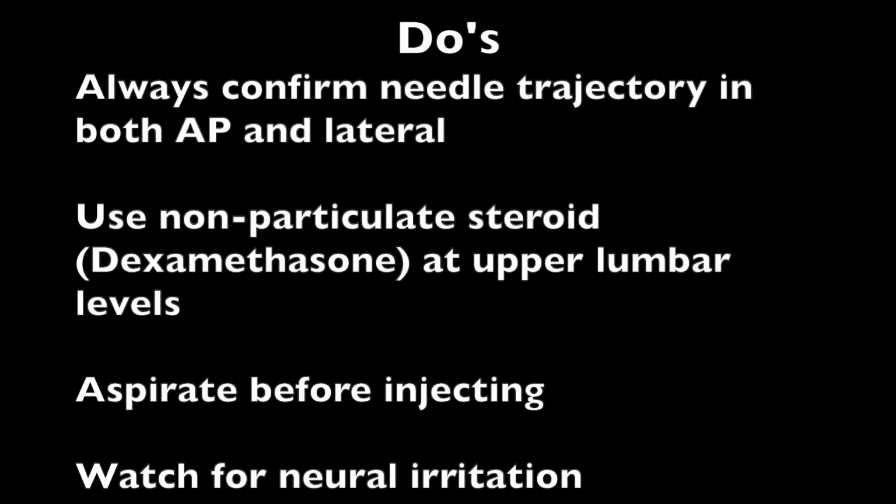The do's of the procedure include: confirm needle trajectory in both AP and lateral views, use non-particulate steroids like dexamethasone at upper lumbar levels. Always aspirate before injection to avoid intravascular or intrathecal entry. Observe for any neural irritation during insertion of the needle.